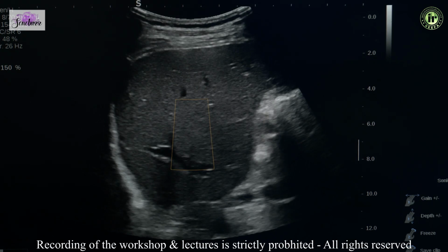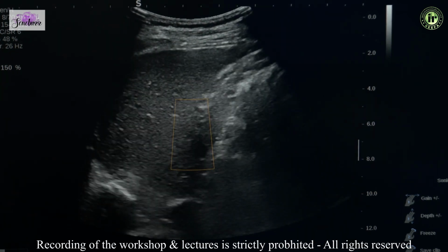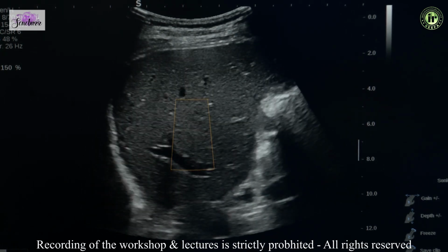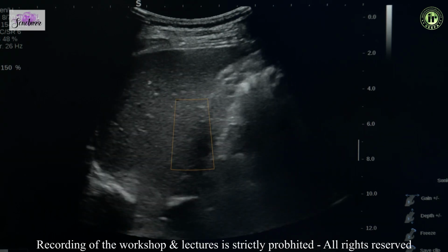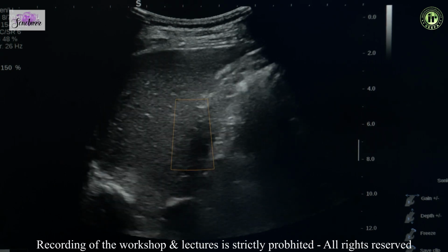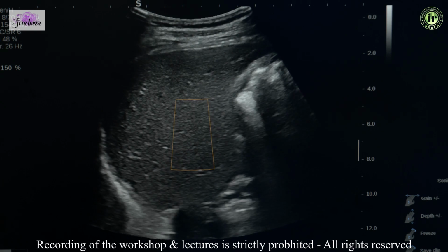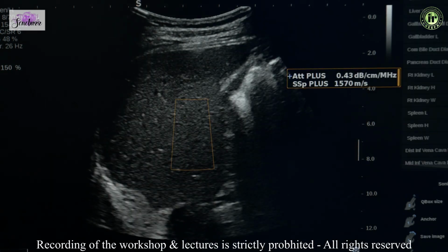The other thing which can be done for the fatty liver is the attenuation coefficient. So what we do over here is we turn on this attenuation mode. We get this big box. The box is not changeable in size, and we have to take the measurements as it is. So again, we ask the patient to stop the breath hold. It's a prudent idea to take at least 3 readings, and then we can take an average of these 3 readings.